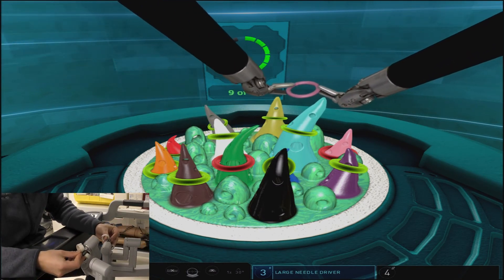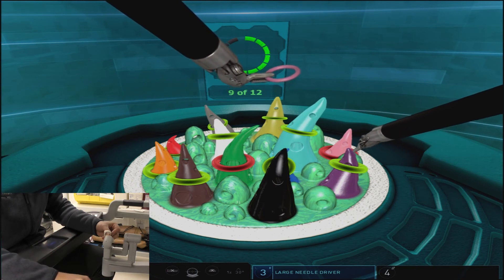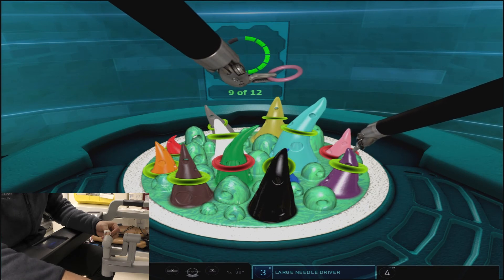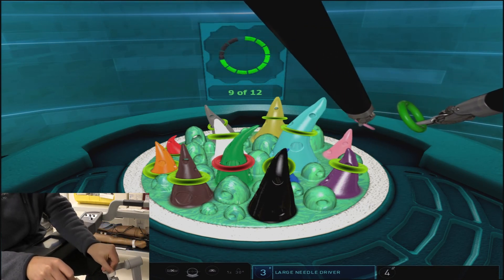Again, you'll see here that in order to best access the incorrect ring on the pink cone, we switch arms because the right arm has the best approach to the periphery of that cone in order to grab the ring without causing collisions.